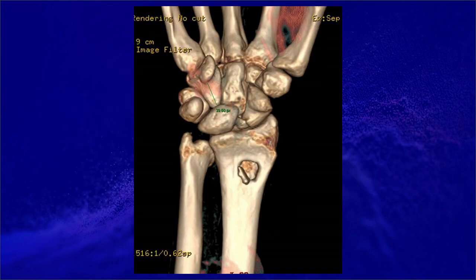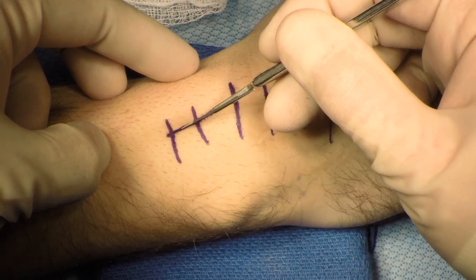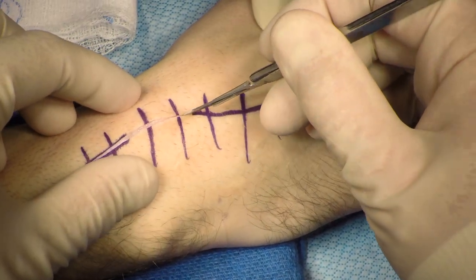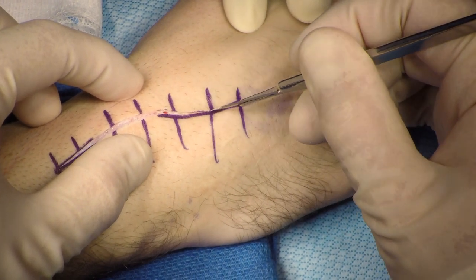The distance from the base of the hook of the hamate to the tip of the hamate was measured in order to ensure appropriate length of the graft can be harvested. The procedure was performed under regional and general anesthesia, and the prior dorsal incision was incorporated.